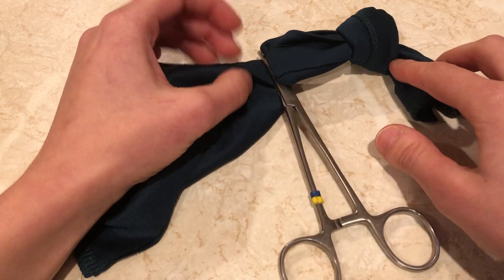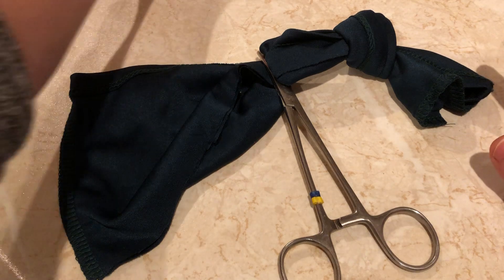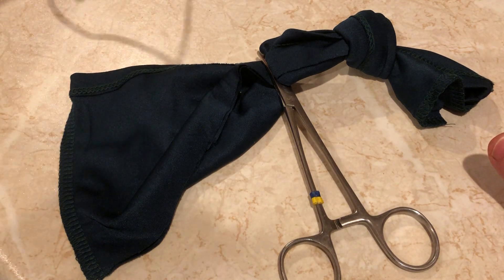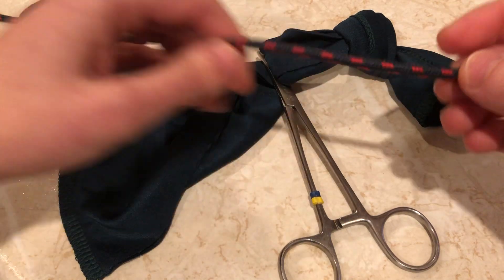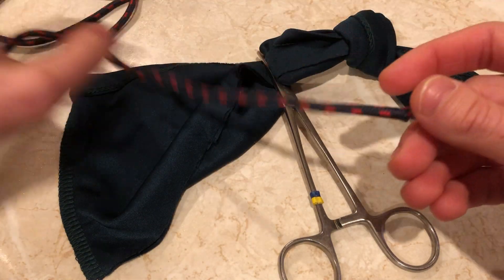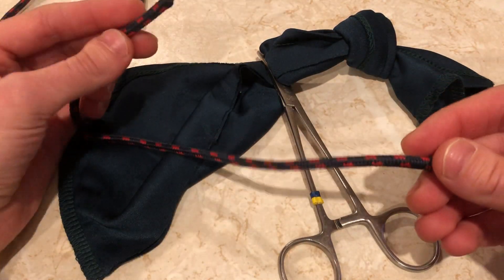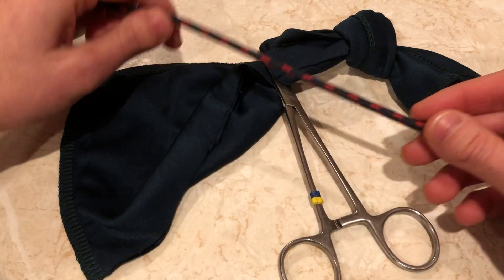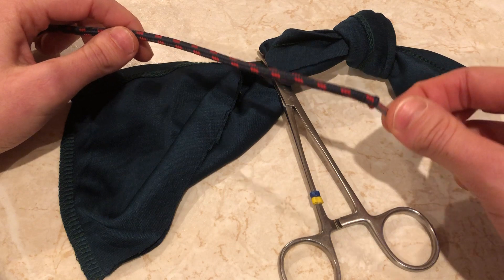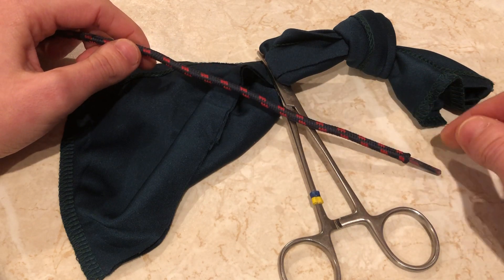Usually I put several clamps on there — I only have one set at home so we're just going to have to go with that for now. I use Vicrol and I find it works really well for this, but whatever you use, I don't usually use anything off the reel so there will be one end with a needle. I tend to keep the needle end away from the pedicle to start with — it's the free end that I use to tie the knot.